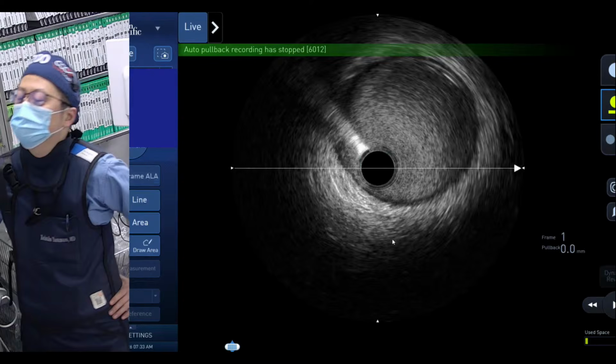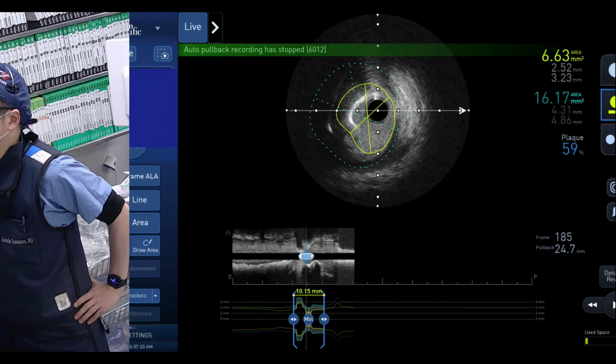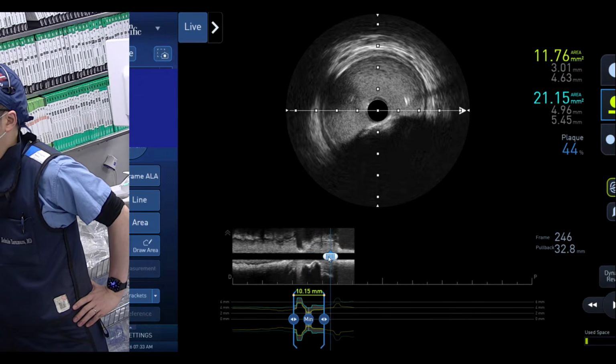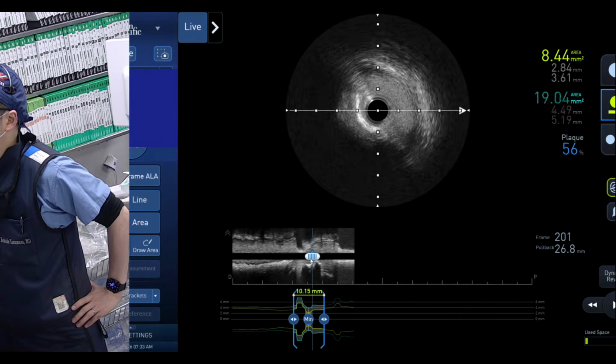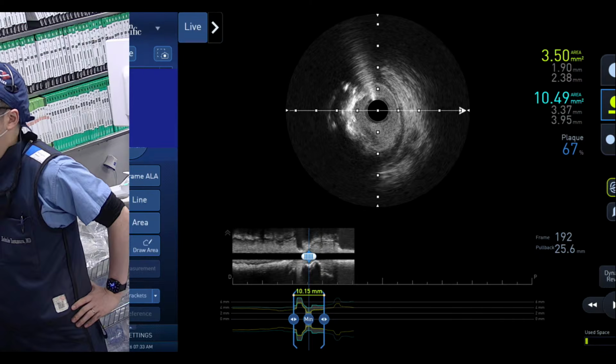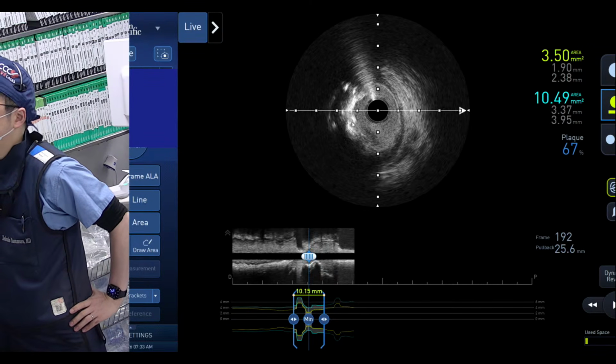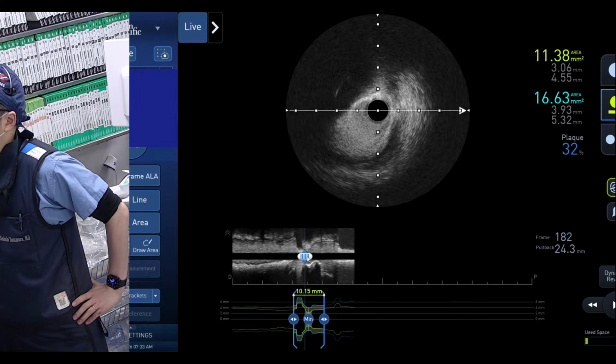Stop it. Maybe just a cutting balloon then. The arc is not that wide. So this is the proximal left main, eccentric calcium. Now come to the distal left main. It looks like a calcified nodule protruding, but the surface is shaved now, with the rota.